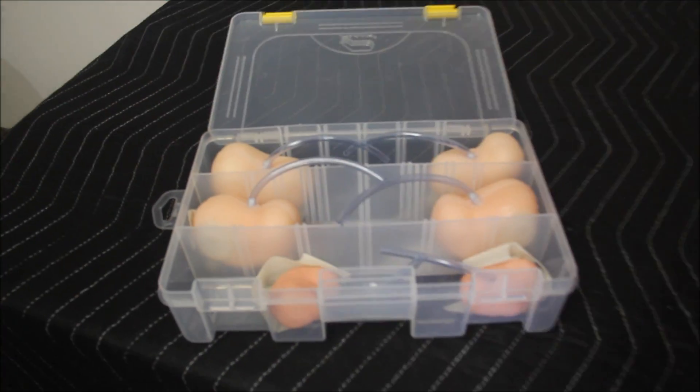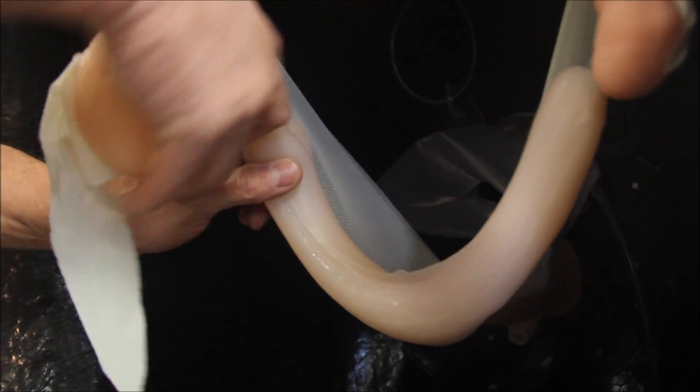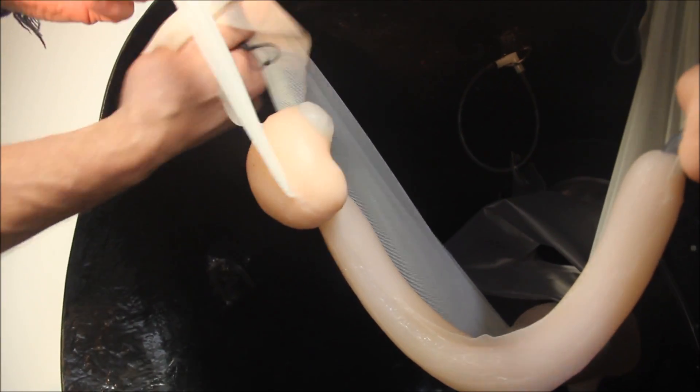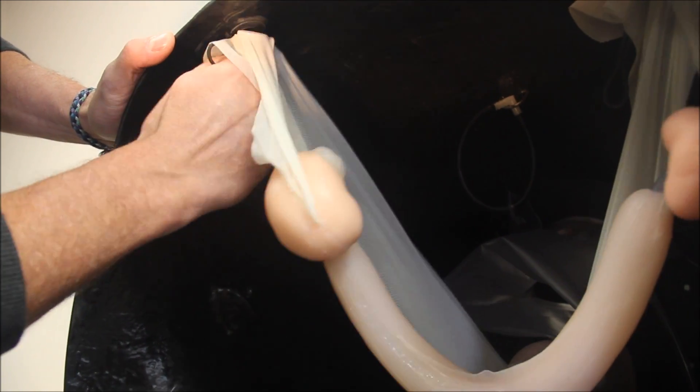There are three different types of ovaries provided: anestrus, estrus, and estrus with follicles. The tubes on each ovary simply insert into the end of the uterine horn until there is approximately one inch or 2.5 cm of tube showing. The attached ligament is then tucked behind the magnet.